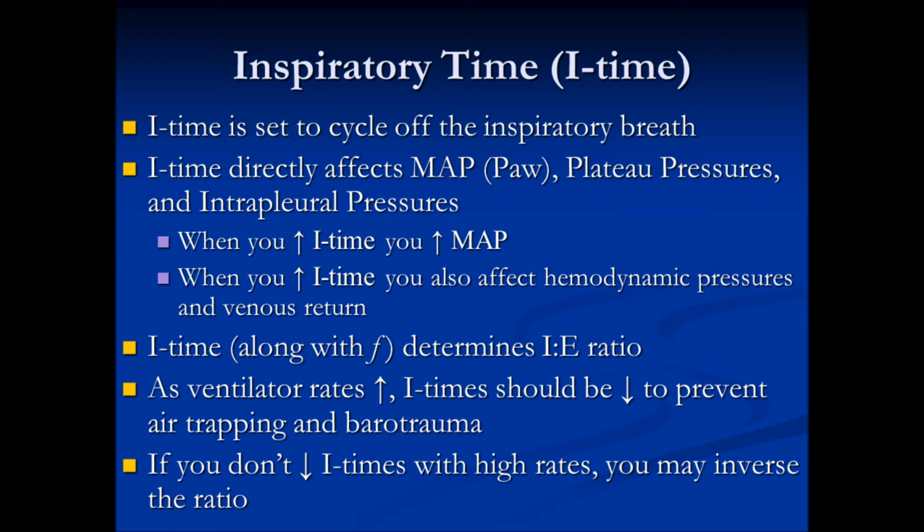Increasing I time helps with oxygenation in that regard. When you increase your I time, you also affect the hemodynamic pressures and the venous return, which is very important. Hence, why the bullet stated that when you manipulate your I time, you directly affect your plateau pressures and your intrapleural pressures.